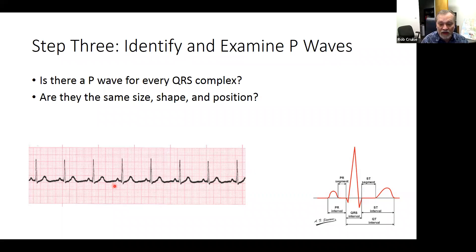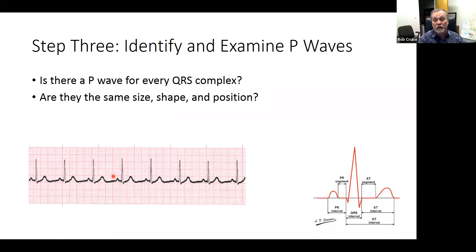Are the P waves the same size? They all look the same size — you can count how many squares they are to be sure. Are they the same shape, or do they have a different morphology? If a few of them look different, that means they were excited from a different area than the others, so the shape is important. Also look at position: is the PR interval the same, or is it different? If it is different, that will clue you into certain pathologies.